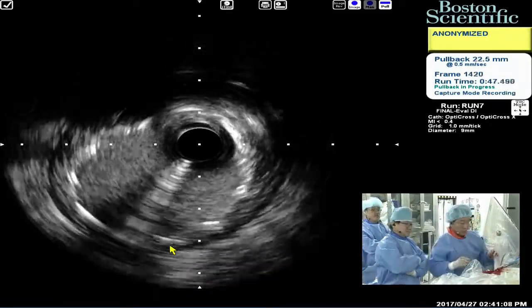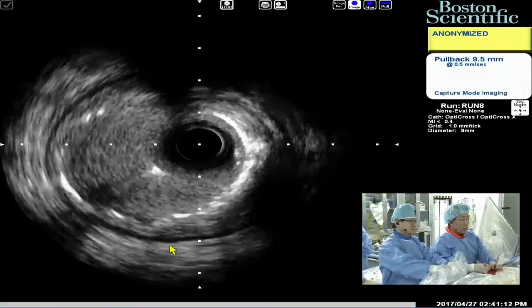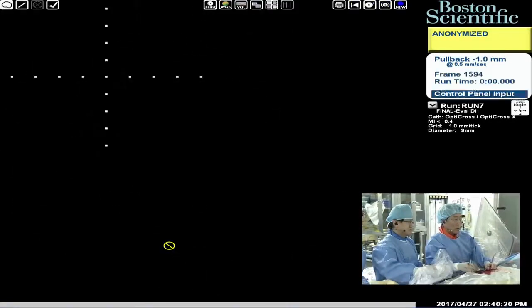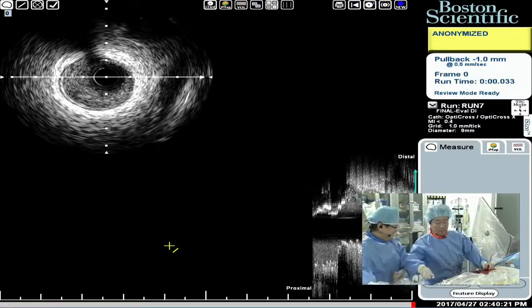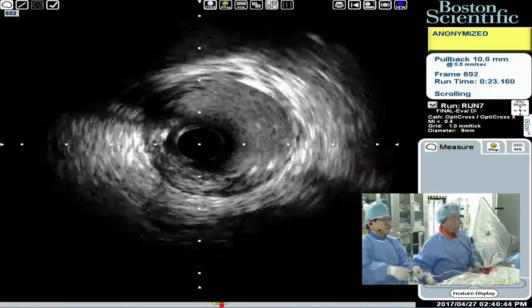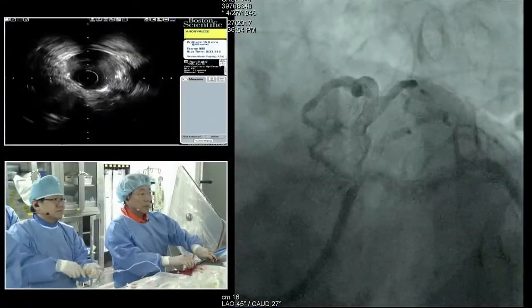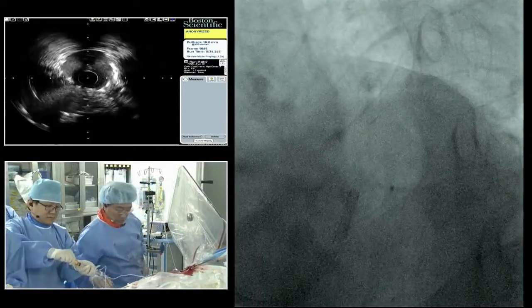And this is proximal area. And then I want to pull the out. Oh, right. Oh, this is just. And wire too. And then take a final shot. Contrast, please. Okay, good. Okay, I'll take a picture here.